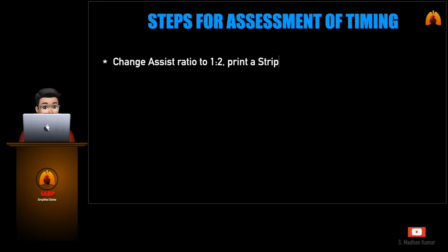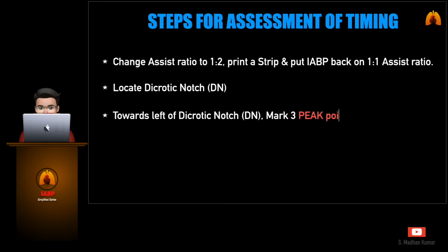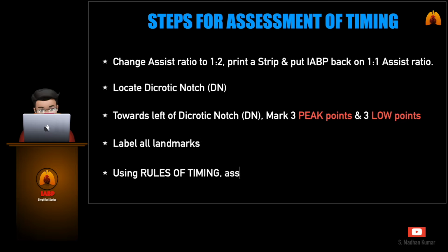The efficiency of intra-aortic balloon pumping depends on the accuracy of the inflation and deflation timing settings. It is imperative that the user fully understands the hemodynamic signs of proper timing and the adverse effects of improper timing. Even if your IABP adjusts and sets timing automatically, timing assessment should be done manually to confirm proper augmentation. The steps for assessing the proper timing are as follows.